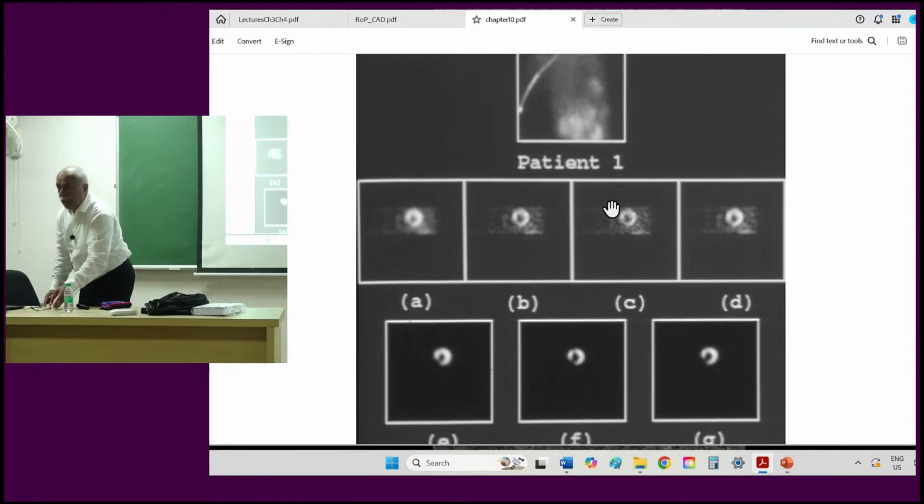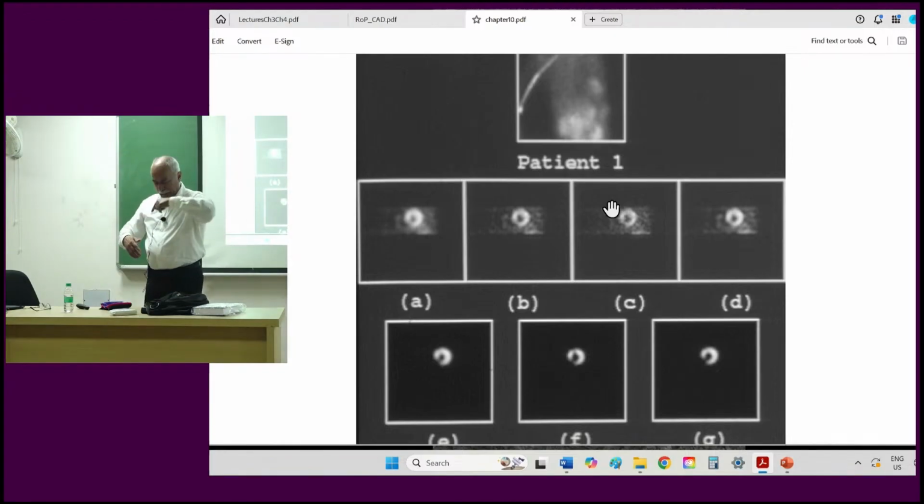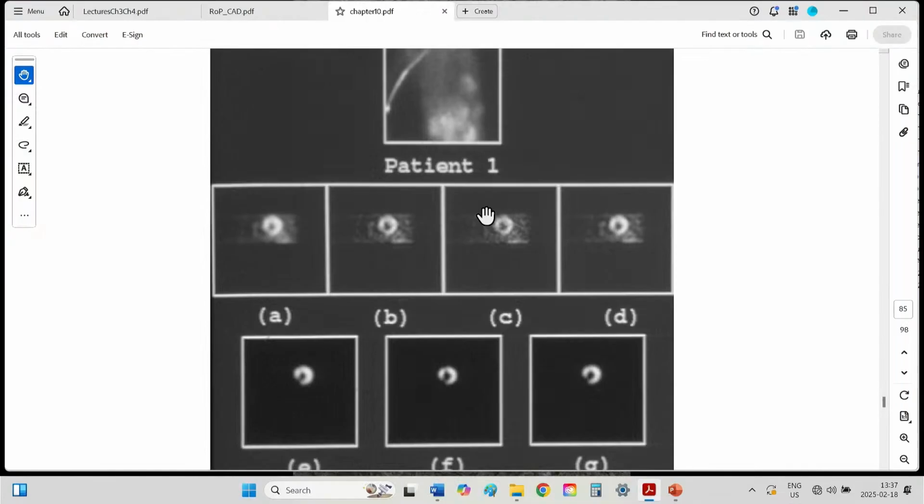This is imaging of the left ventricle. This is one of the projection images at some angle. So for this type of imaging, they go 180 degrees here, not the other side. From here to the other side, 180 degrees. And that's one of the projection images. The heart is here. The abdominal organs also have taken up the radioactive material. There's also the intravenous tube there. Well, you're interested in this part, and that is reconstructed in some 3D, and some other planes are cut.